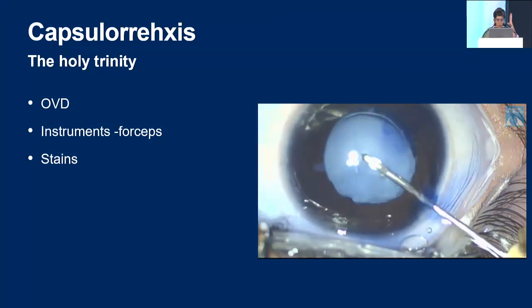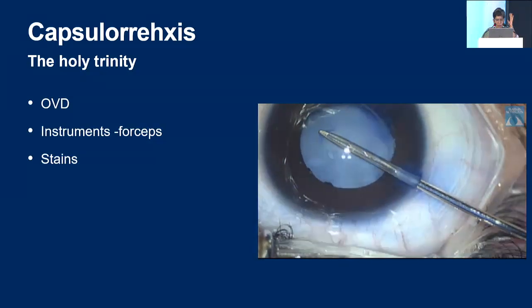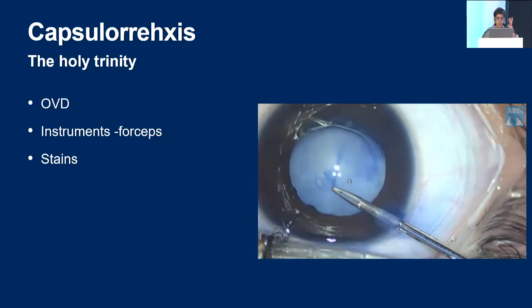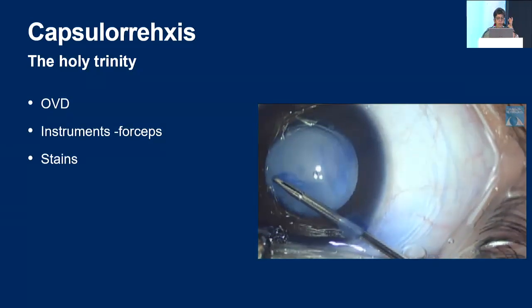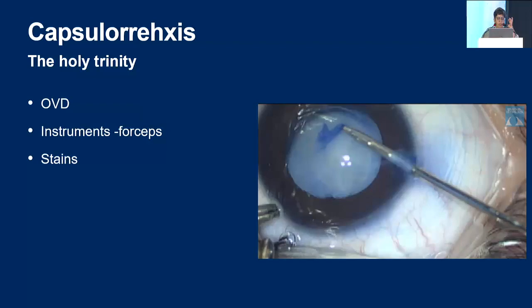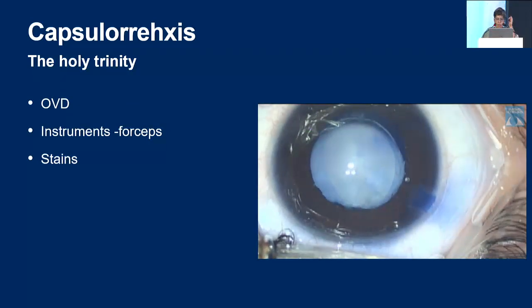In capsulorrhexis, the holy trinity of a good OVD, instrument like forceps, and stains are absolutely indispensable. A cataract like this, a few years back when stains were not available, would have been almost impossible — I would have used a light pipe for illumination and there was still a good chance of extending it. But now, with staining and a very stable anterior chamber, it is really not that difficult. As you can see, my forces were always directed towards centre. A microcapsular forceps also allows you to do the rhexis through a side entry through a small incision without doing the main tunnel.